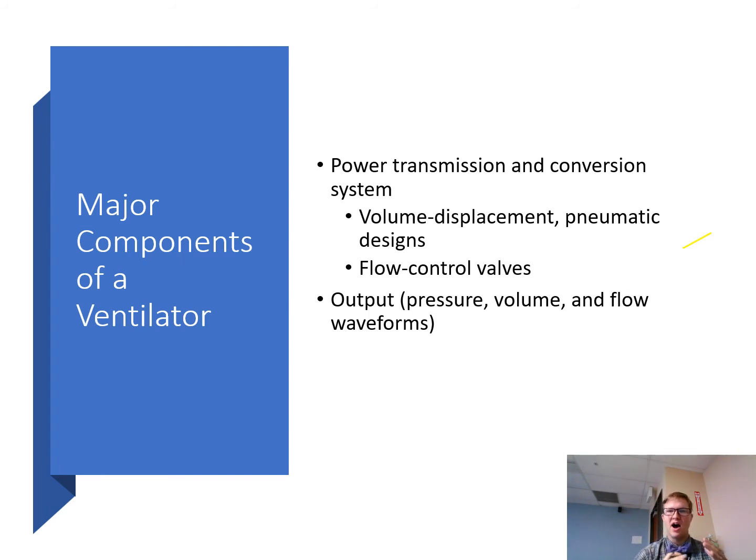They operate as a way to help with breath delivery from millisecond to millisecond in some of the modern ventilators. These flow control valves include proportional solenoid valves and digital valves with on-off configuration. So we can change different things breath to breath or even in the middle of a breath sometimes. A proportional solenoid valve is designed with various configurations to modify the gas flow. So how do we modify the gas flow? Well, that's a solenoid valve that's doing it.